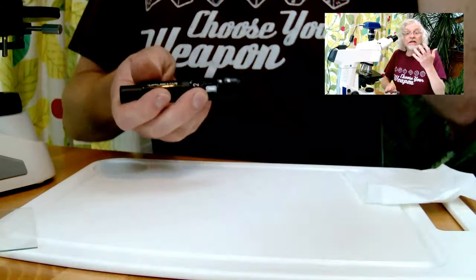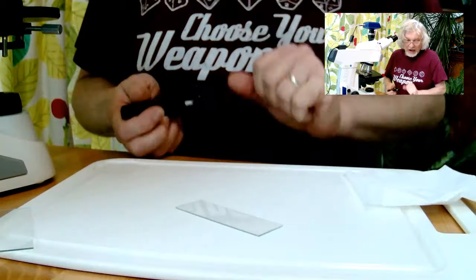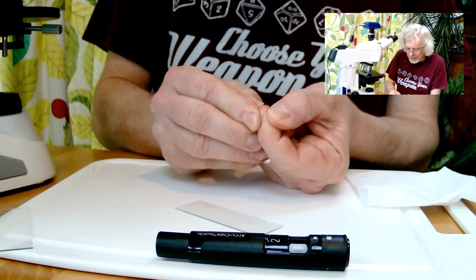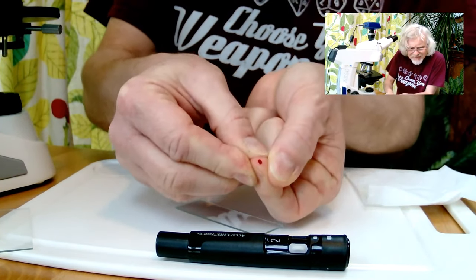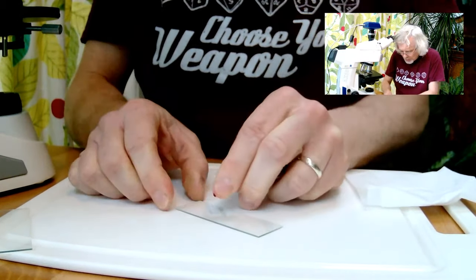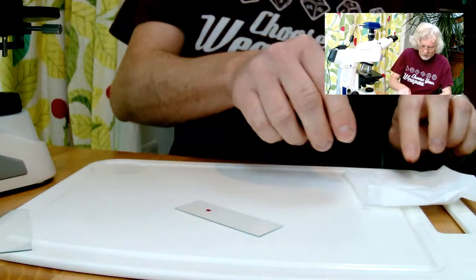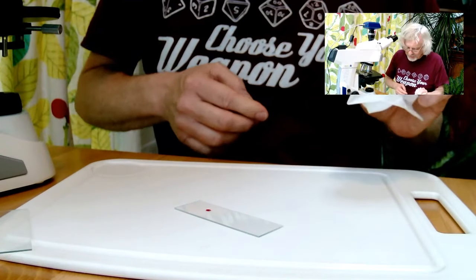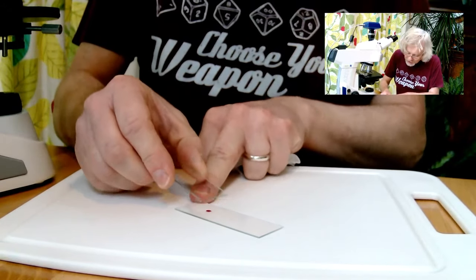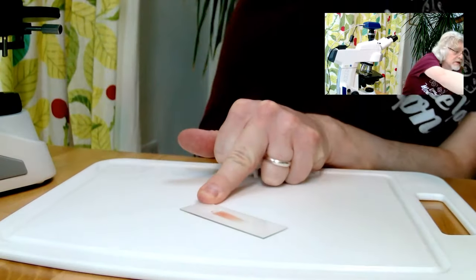What I need to do first is take some blood and smear it out on this glass slide. So I do that, and then we get a drop of blood. You can see the blood. I'm bleeding for you. Don't say I don't do anything for you ever. Then I put that drop of blood on the slide about there. It's a bit of a small drop, actually, this one. Then I try and staunch the bleeding, because I don't want to bleed all over my lovely microscope. And then I need to smear that out so that we can see individual cells. Like that. I'm going to get rid of that.